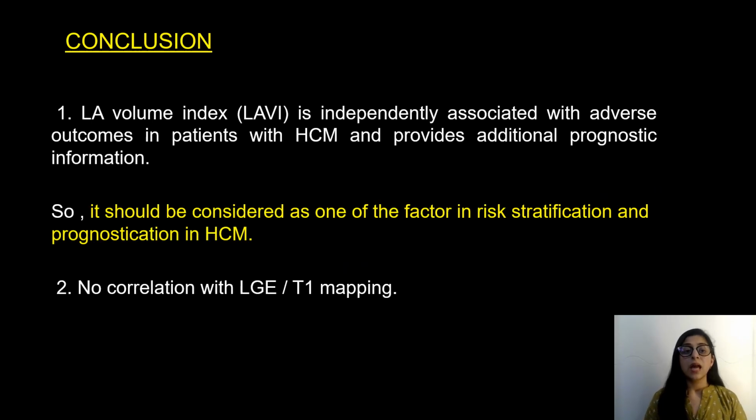My conclusion is that LA volume index is independently associated with adverse outcomes in HCM and provides additional prognostic information. So it should be considered as one of the factors in risk stratification and prognostication.